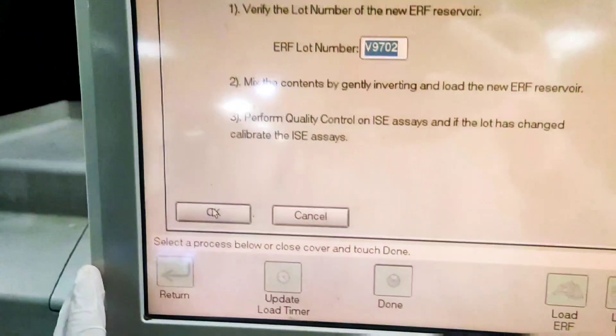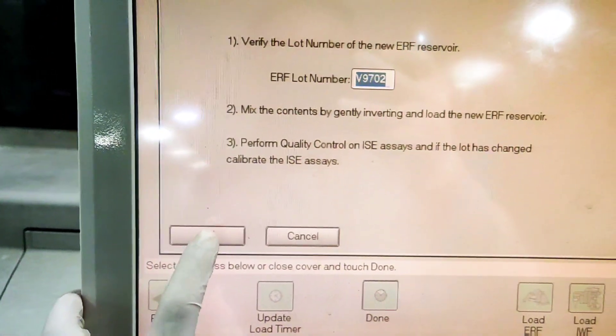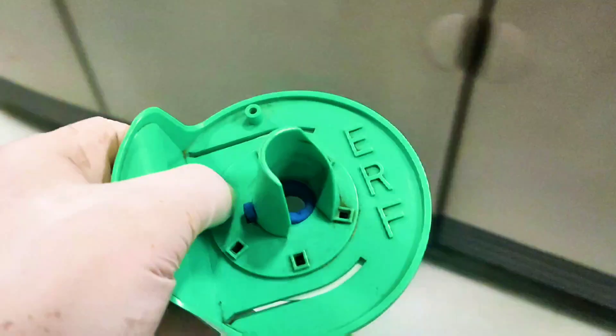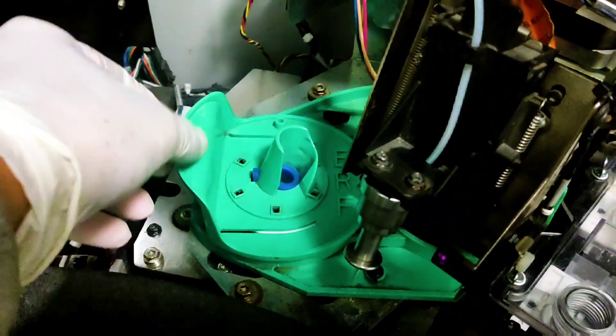After the test has passed, only then are we allowed to enter the lot number of our new fluid. We will enter the new lot number and finally place the reservoir with the new ERF into the system.